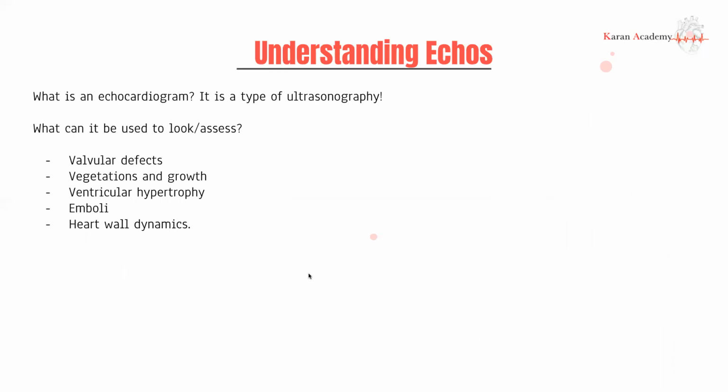Now, understanding echocardiograms. This is just a one-page, very quick guide. Not thorough in any way or form, but what is an echocardiogram? It's a type of ultrasonography, which is specifically used to assess different parts of the heart. So what can we look for?